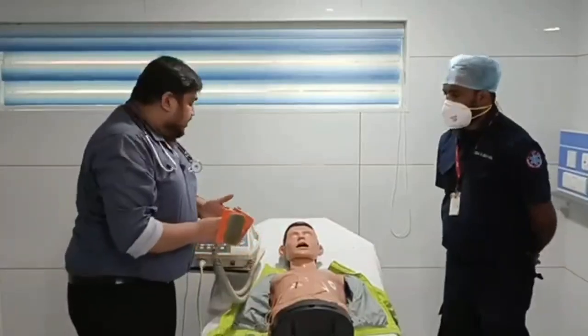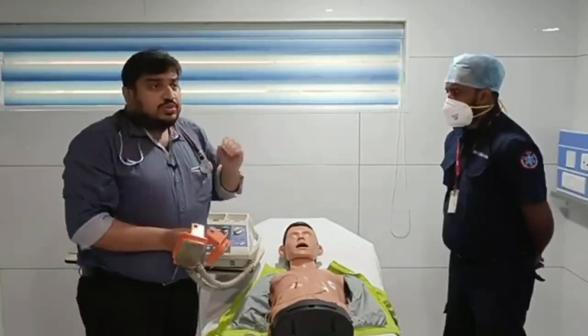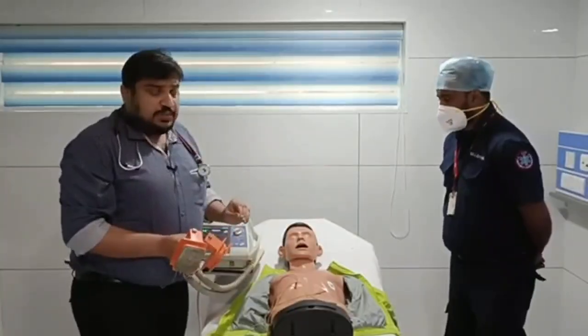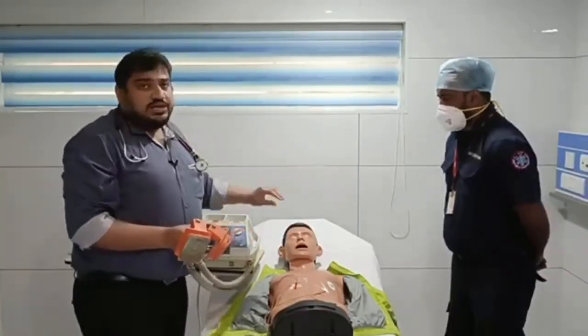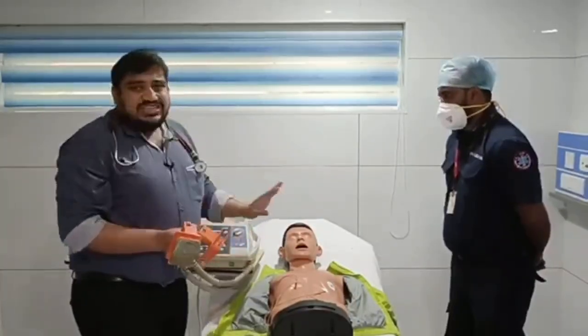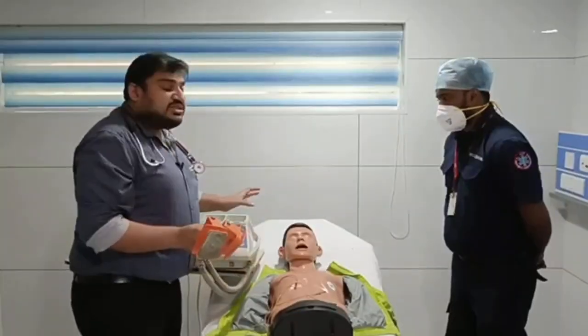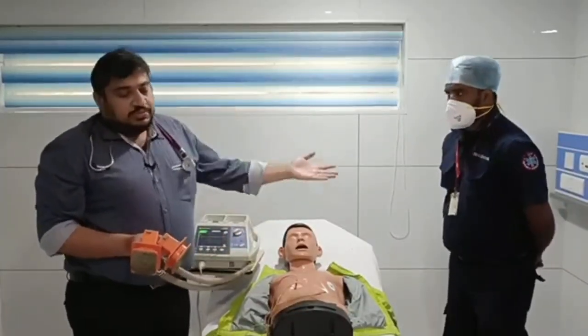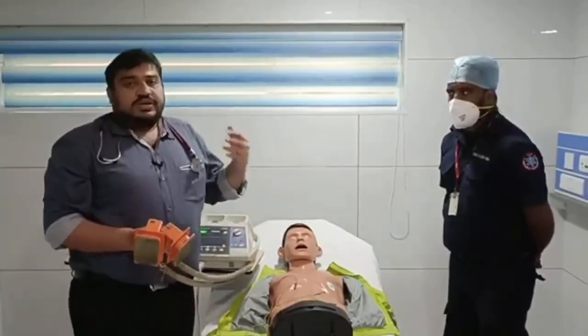Once the contact is made, you have to shout out loud, "I am clear, everybody clear." Nobody should be touching the patient, and the oxygen source ideally should be cut off. If somebody is touching the patient at that moment, there is a high chance that the other person will get electrocuted. So nobody should be touching the patient.